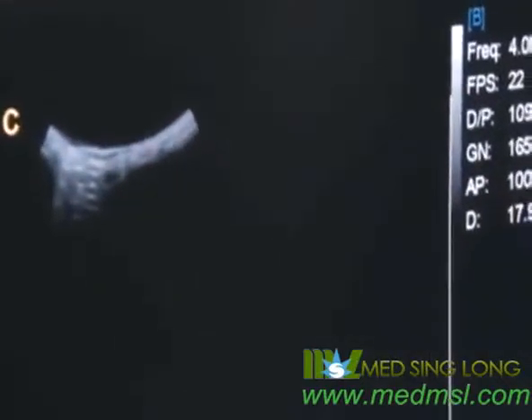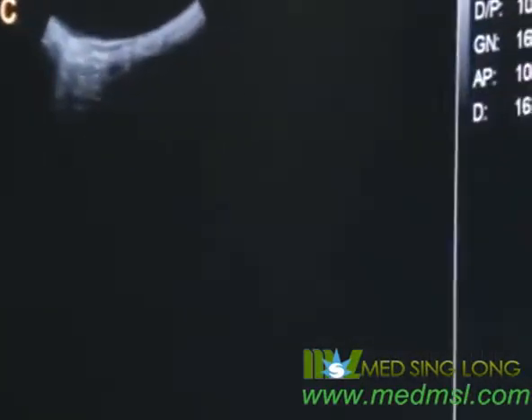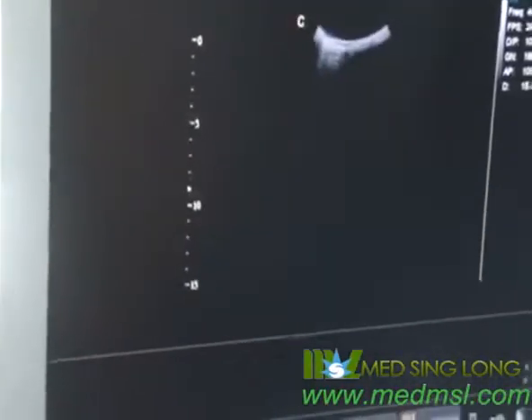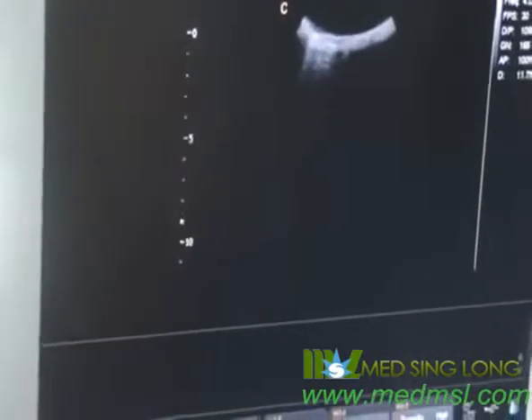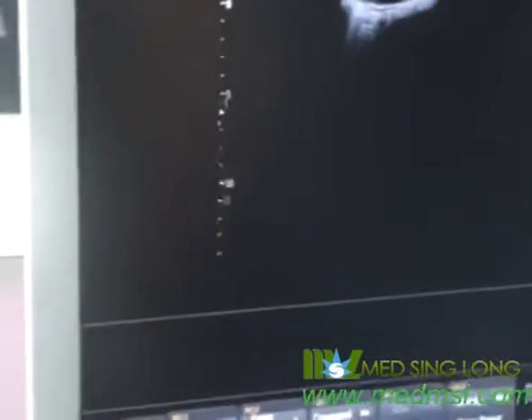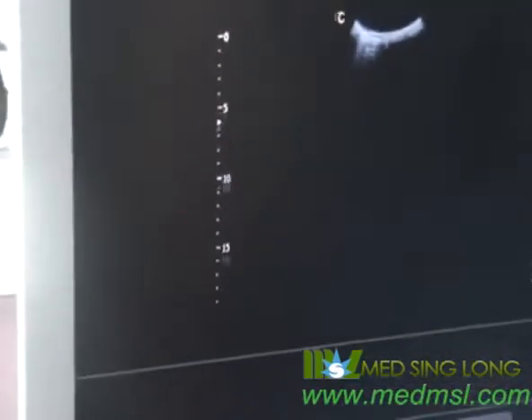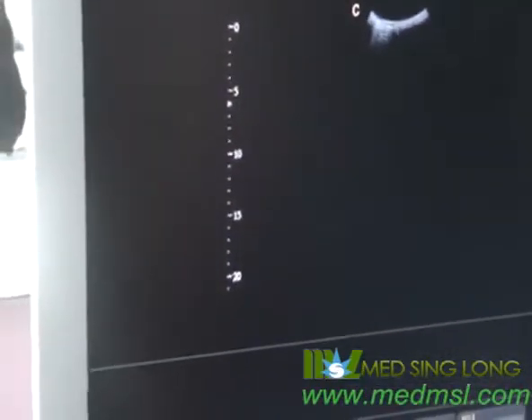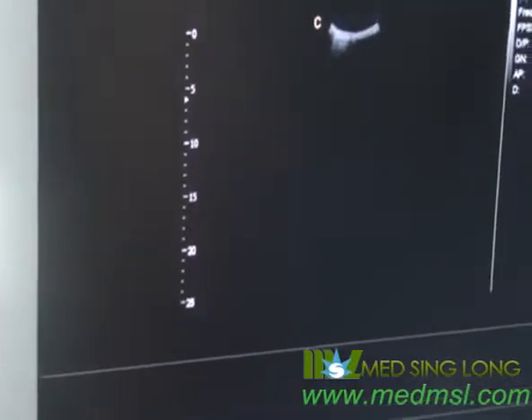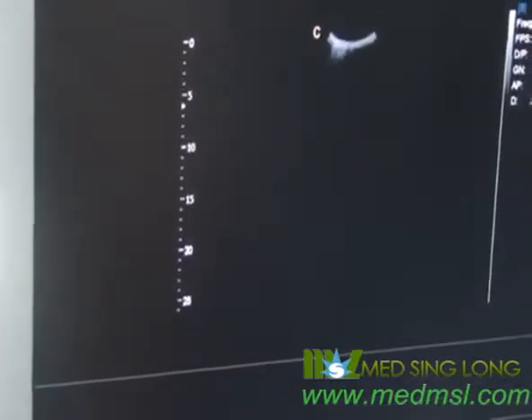For depth adjustment, use the up and down controls to change the depth. Press up to decrease the depth, and down to increase the depth. We can change the depth according to the patient's size.